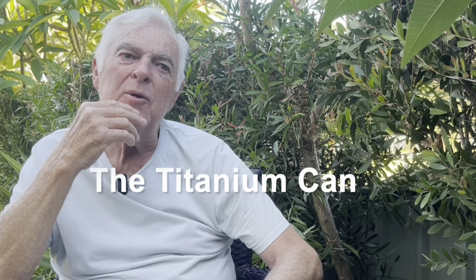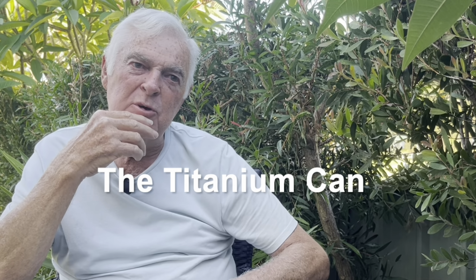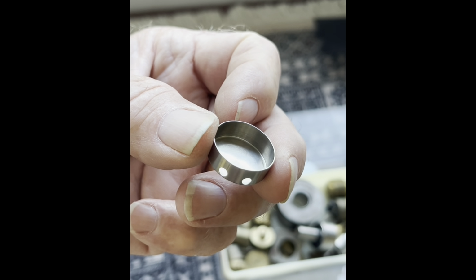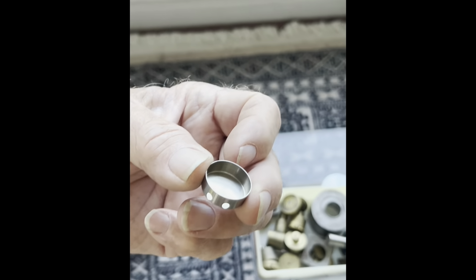The can that I made, I said to them originally that it should be pressed, and they said, well, we don't know what thickness of titanium we need to get. I think it was $40,000 worth to get a batch of this thickness made, and if that didn't work, another $40,000. In the initial stages they weren't sure enough to spend the $40,000, so I turned these cans, which were about 20 millimetre diameter with a 0.2 wall thickness and about 8 millimetres high. Of a millimetre. So wow.